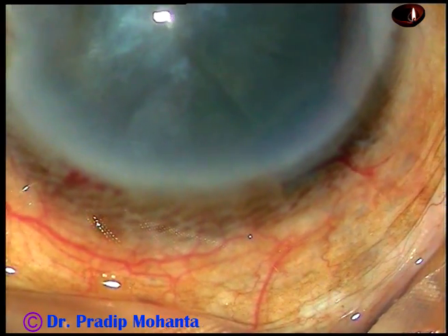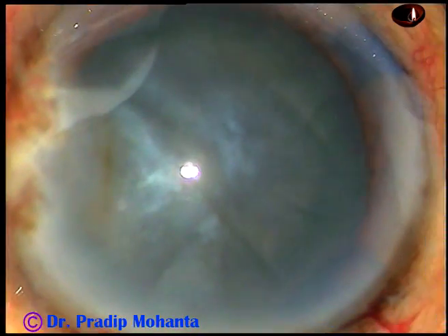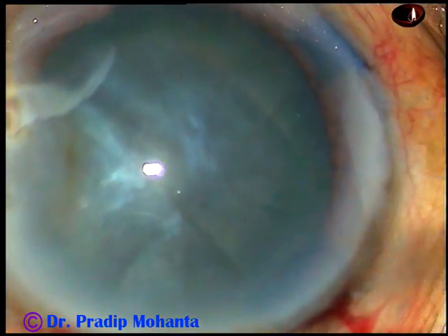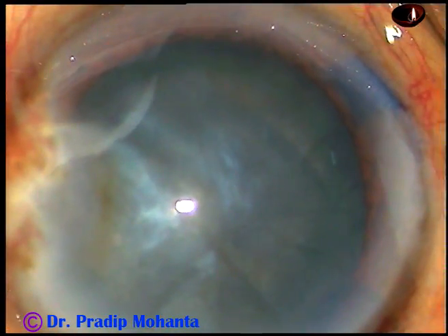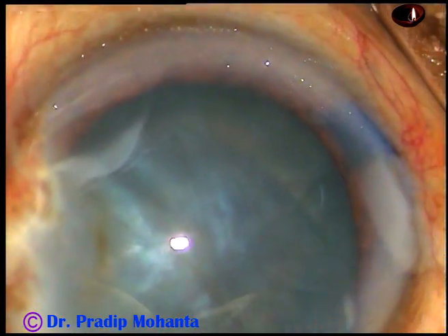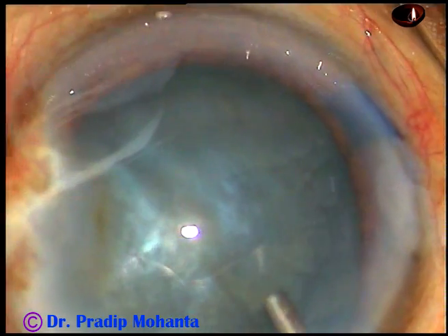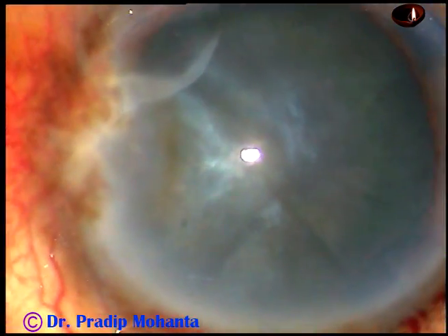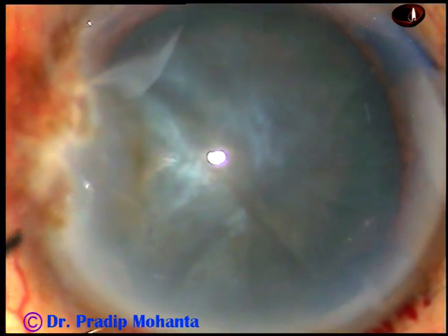Now 2% hydroxypropylmethylcellulose is injected into the anterior chamber. From the appearance, I thought this is an intumescent cataract. We can see some opacities in the anterior part of the cataract.